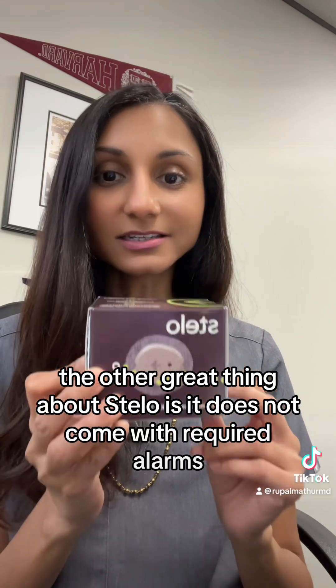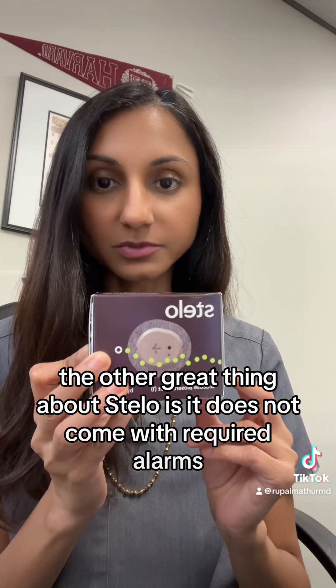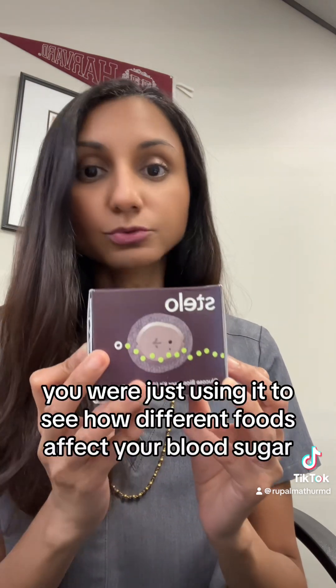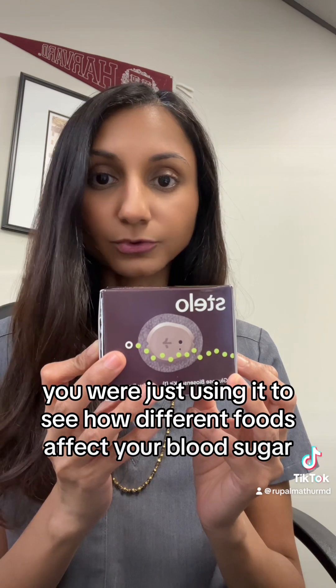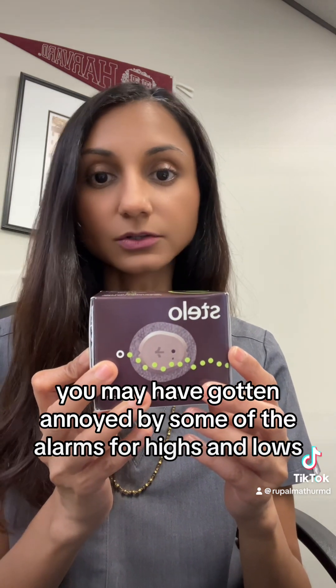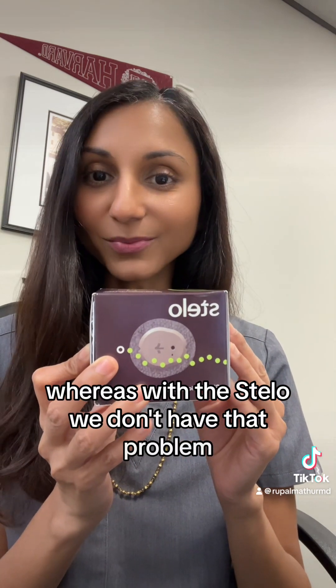The other great thing about Stelo is it does not come with required alarms. If any of you have ever worn a Dexcom or a Freestyle Libre and you don't have diabetes — you were just using it to see how different foods affect your blood sugar — you may have gotten annoyed by some of the alarms for highs and lows. With the Stelo, we don't have that problem.